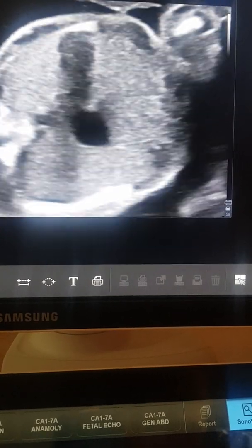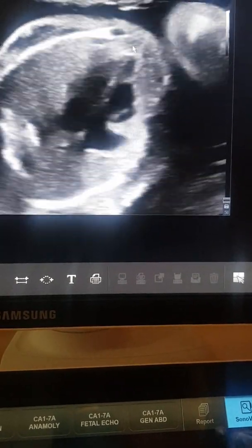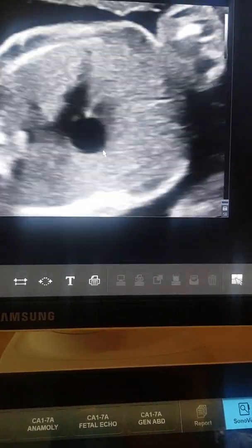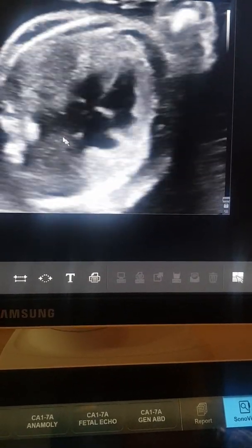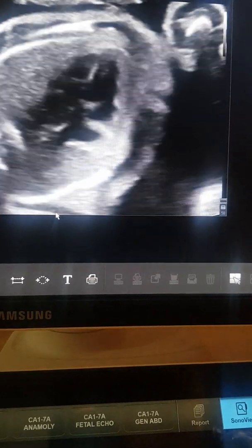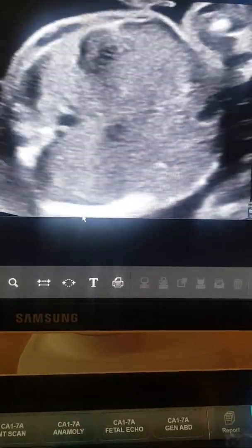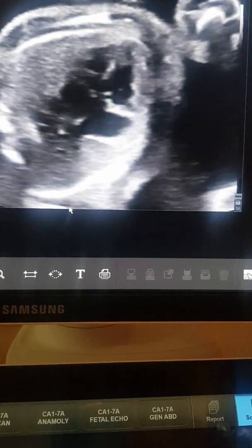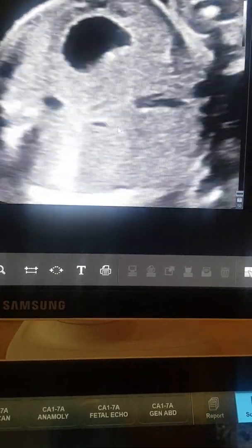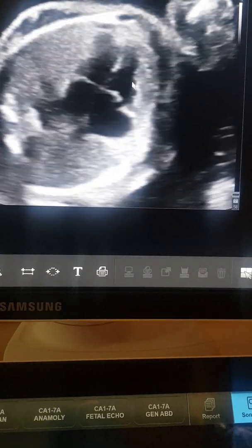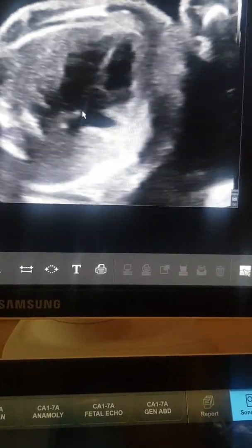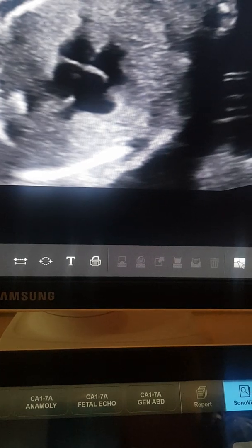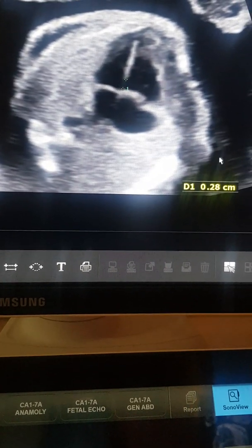The cardiac apex is pointing to the left, the size of the heart appears normal, and the squeeze of the heart appears normal. In the abdomen, the IVC is on the right side, aorta is on the left side — there is normal abdominal situs and levocardia. The first appearance of the four-chamber view shows that the symmetry of the chambers is lacking; there is asymmetry with a slightly small-sized left atrium and left ventricle compared to the right atrium and right ventricle.